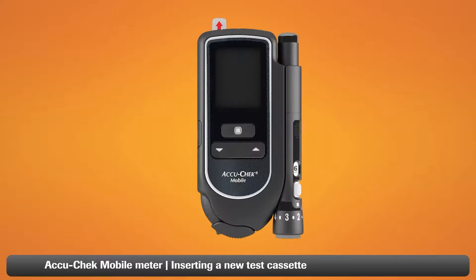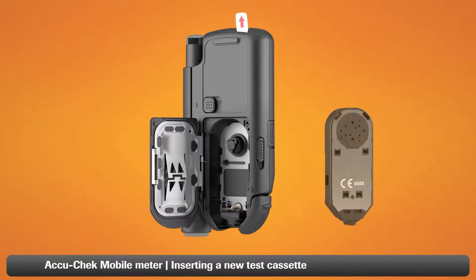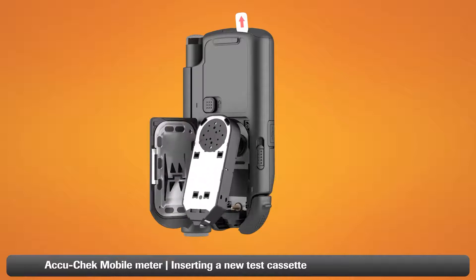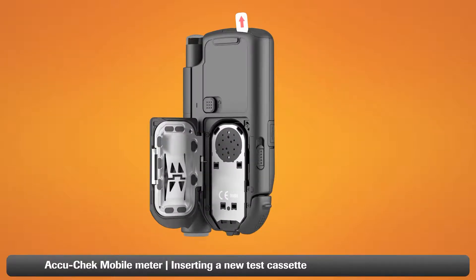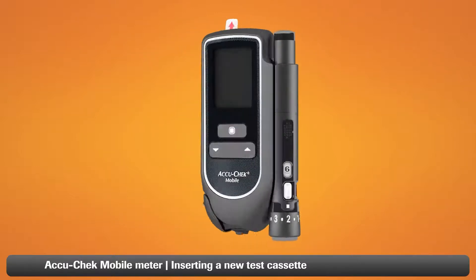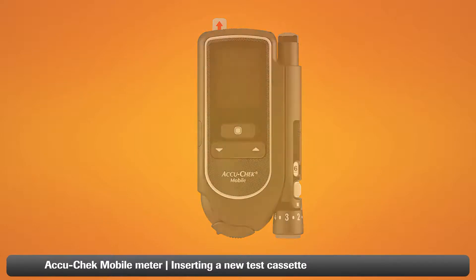To insert a new test cassette, open the tip cover of your AccuCheck mobile meter completely as far as it will go. Turn the meter over and push the button for the cassette compartment cover upwards to open it. Insert the new test cassette in the meter as shown. Please note that you must use an unpacked test cassette within the next 90 days. Then close the cassette compartment cover and close the tip cover. Your test cassette is now loaded and ready to use.